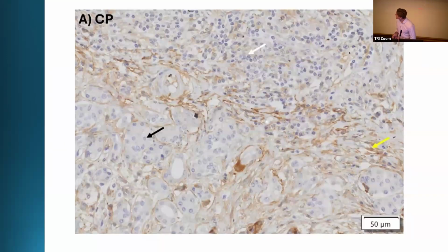So these are some of the immunohistochemistry slides which tell a good story. So this is chronic pancreatitis, and you can see the immune infiltrate up here. These are normal pancreatic ducts, non-neoplastic. And as everyone here, I'm sure, is aware, the brown is the staining for FAP. And you can see that it's only in that fibrous stroma which is surrounding the ducts, which is classic of pancreatitis.